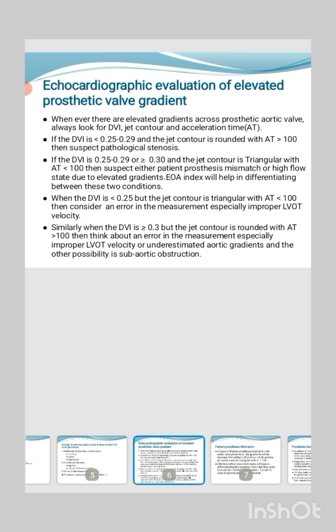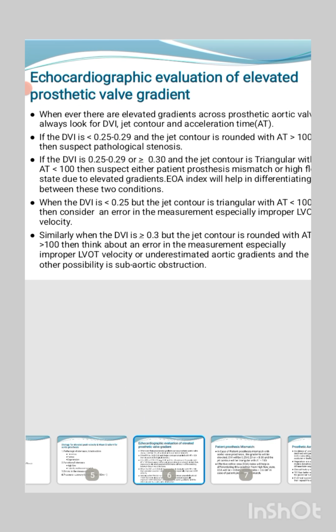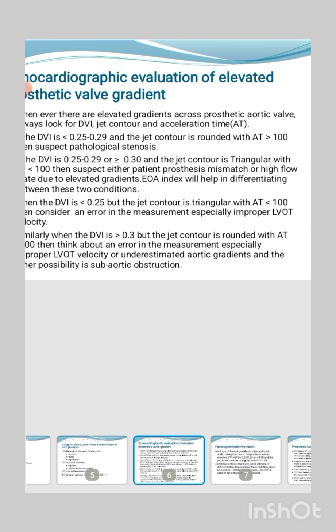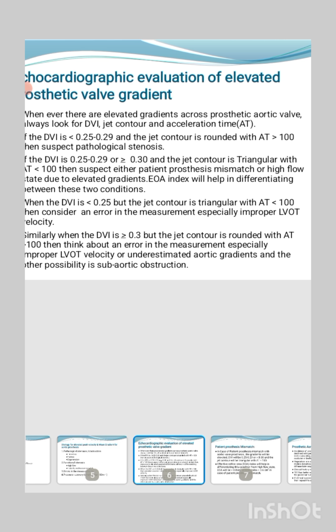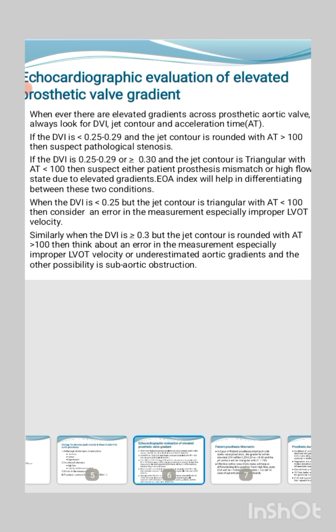Echocardiographic evaluation of elevated prosthetic valve gradients. Whenever there is an elevated gradient across a prosthetic aortic valve, always look for DVI, jet contour and acceleration time.